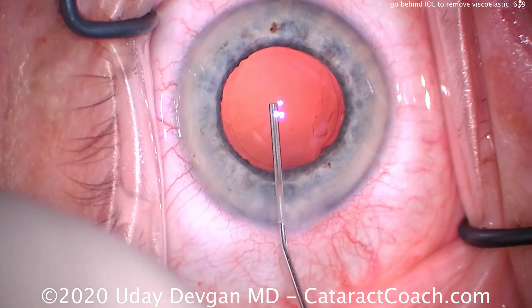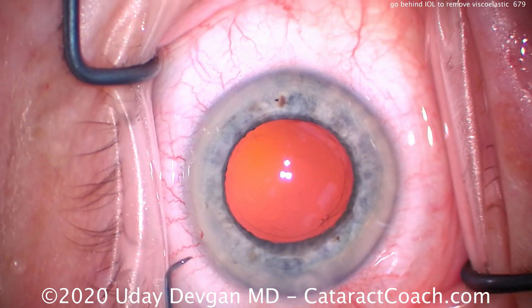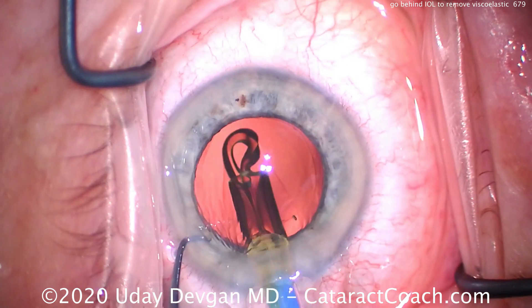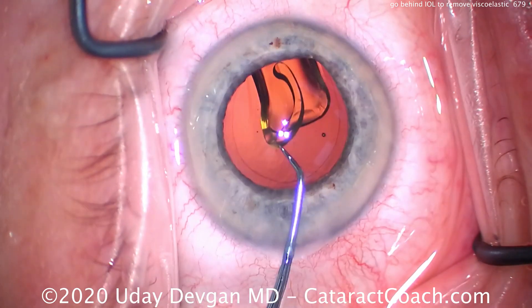We're used to this scenario. The capsule bag is empty, we fill it up with a cohesive viscoelastic, and then we inject our IOL into the capsule bag. We've all done this maneuver many times during routine cataract surgery. But when we put this IOL in the capsule bag, the optic is going to trap some viscoelastic behind it.